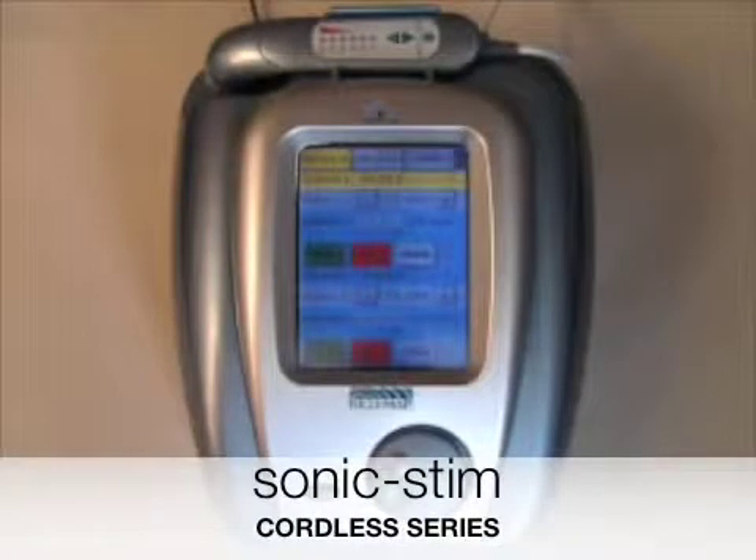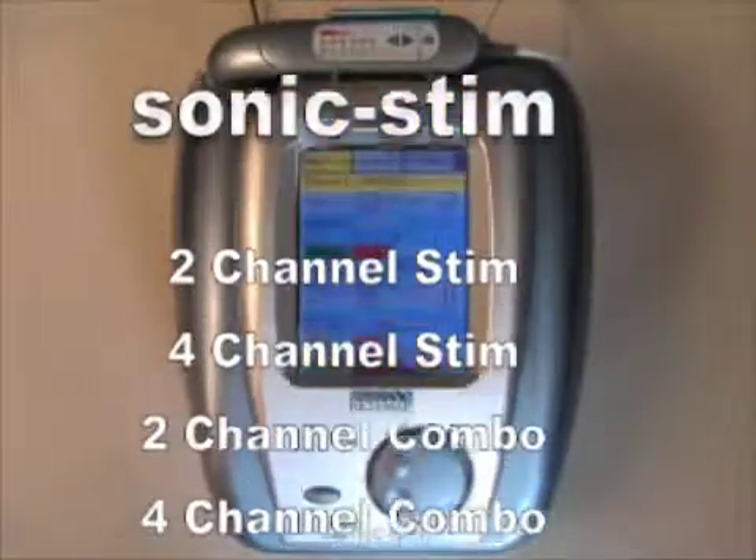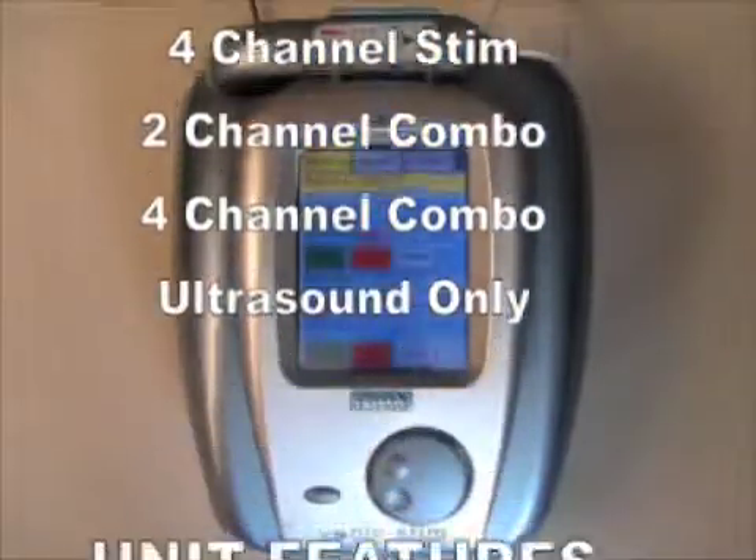The Richmar Sonic-Stim Cordless series has five independent models: two and four channel stim, two and four channel combo, and ultrasound only.